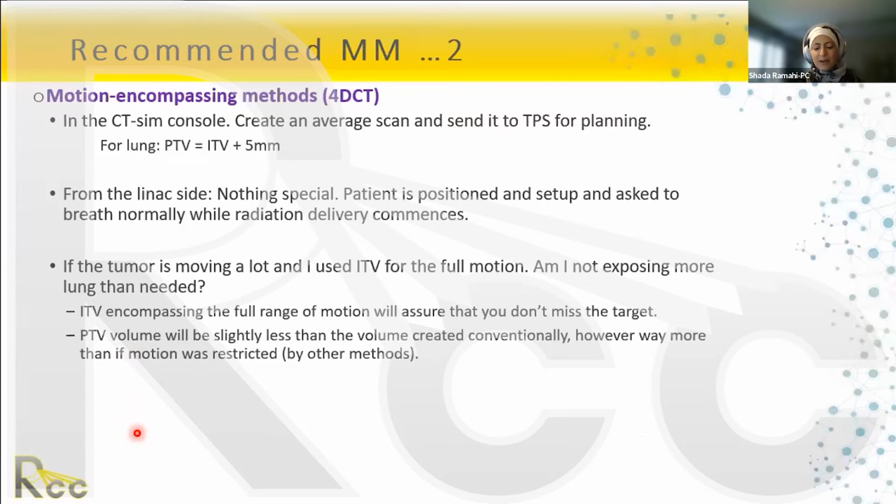Because if you want to have higher doses per fraction, hypofractionation, we want to escalate dose to the tumor and save dose to organs at risk. And we have to have a very sharp gradient. 4 cm of motion will not cut it. And actually the RTOGs do not recommend anything beyond a certain motion range. And we'll keep that as a secret for the next few slides.